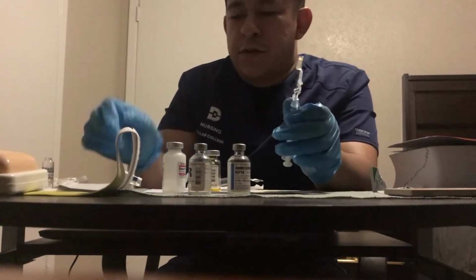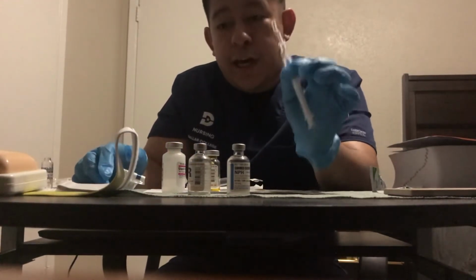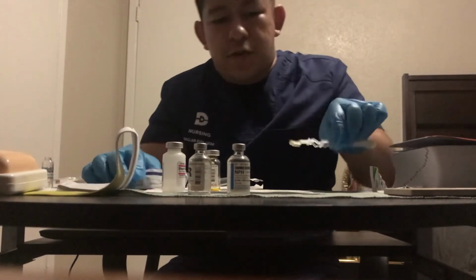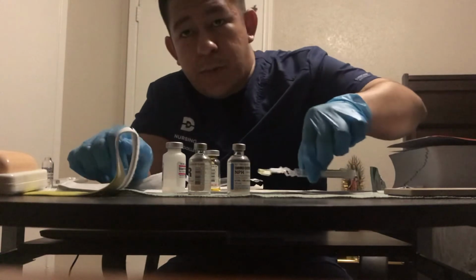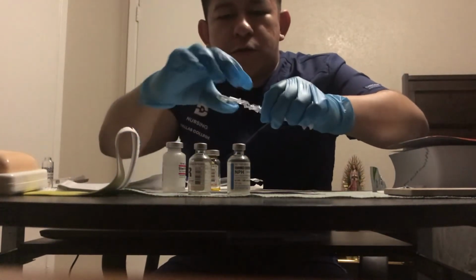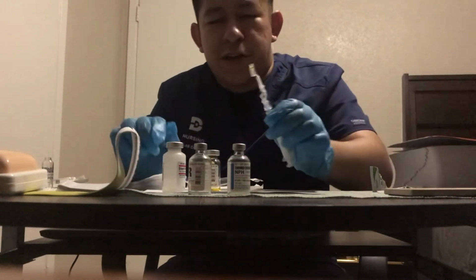But if you don't have a needle, then you could recap this using the scoop method. So with the scoop method, you simply push the cap up against something hard and then scoop it up, and once you know it's on, you just firmly put it back into place.